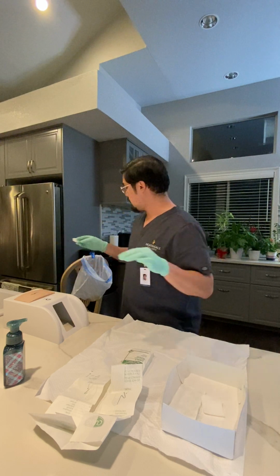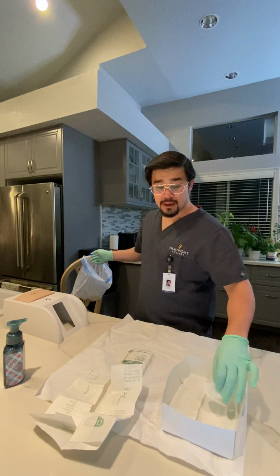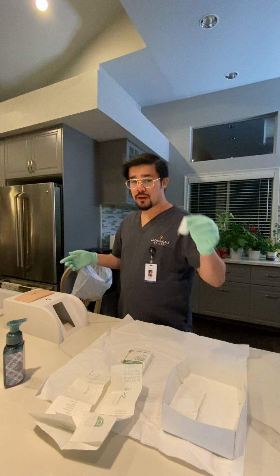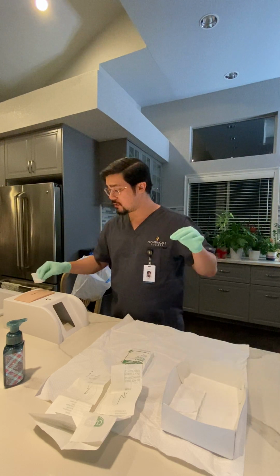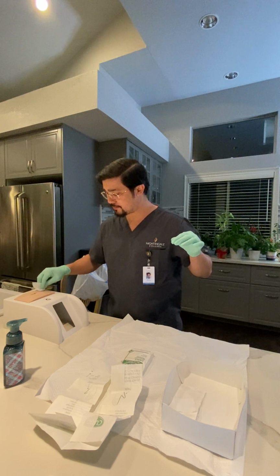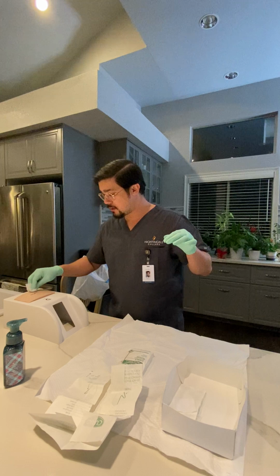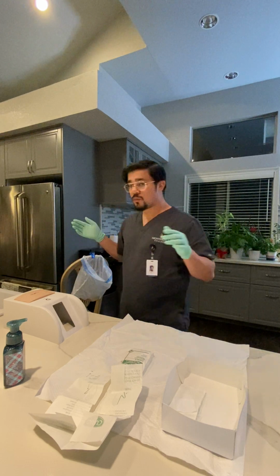Then I'm going to take that gauze and discard it into my biohazard bag. Then I'm going to take the next gauze and work my way around the outside of the wound, patting dry. So I've done one pass around the outside, taking the gauze and throwing it into the biohazard waste bag.